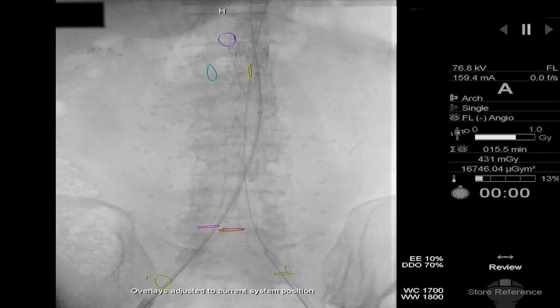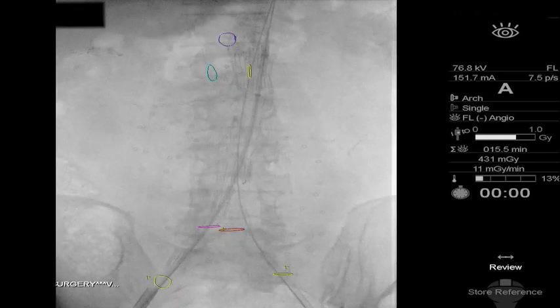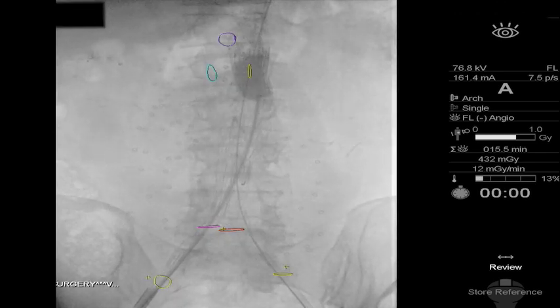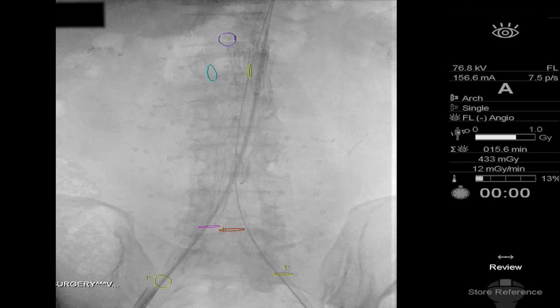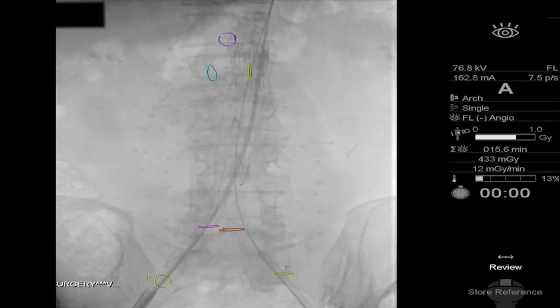After the endograft is fully deployed, use a compliant moulding balloon to optimize the seal at the aortic neck, iliac gate and distal iliac limbs. Take care not to overinflate the balloon to minimize the risk of artery rupture.